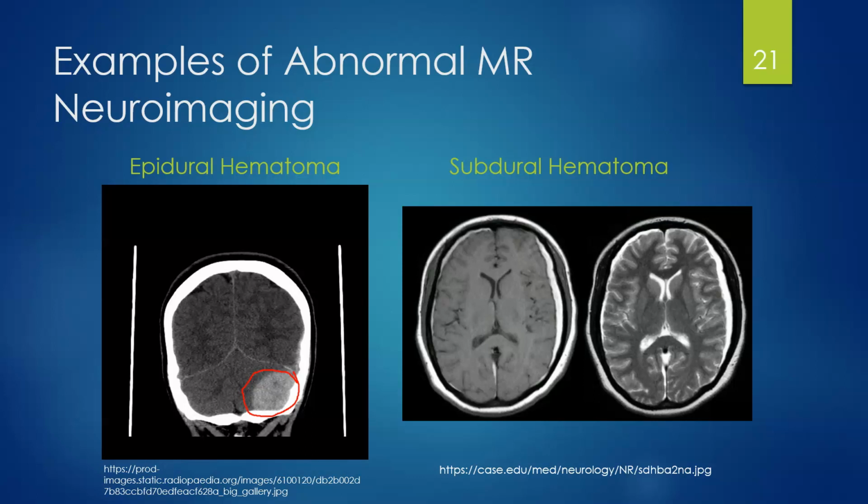On the flip side, we have our subdural over here on the right side, and we see this big wad of abnormal looking signal here, but it's uniform throughout. It's separate once again from the cerebral spinal fluid, always being a different color because it's a slightly different makeup than the free-flowing water. It's going to be that stagnant venous blood that is collected underneath that dural membrane as opposed to on top of it.